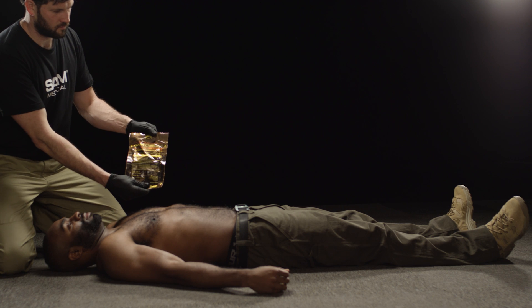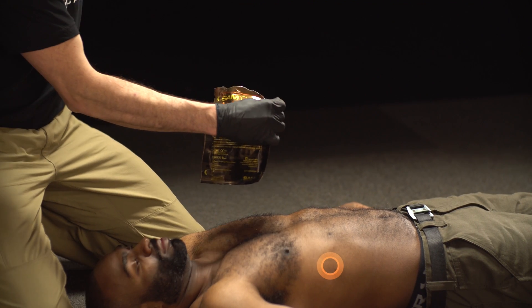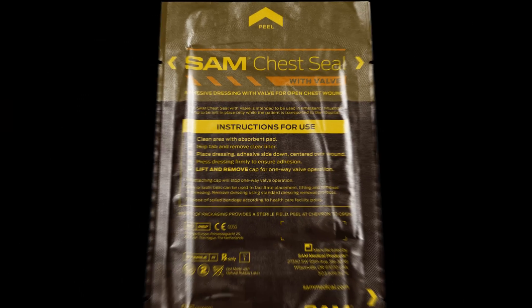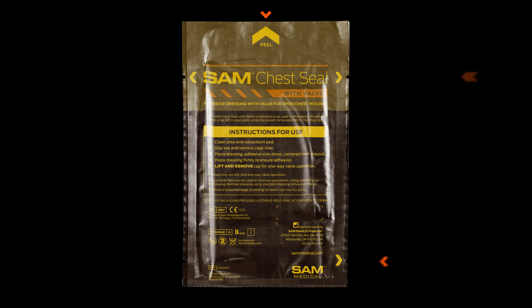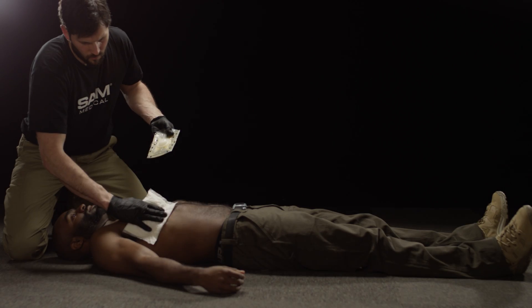Locate the wound, remove the patient's clothes, and run your fingers on the chest and back of the patient to ensure you have located all wounds. Quickly and easily open the sterilized SAM Chest Seal packaging by peeling it from tabs or tearing along the chevron marked notches. Clean the wounded area.